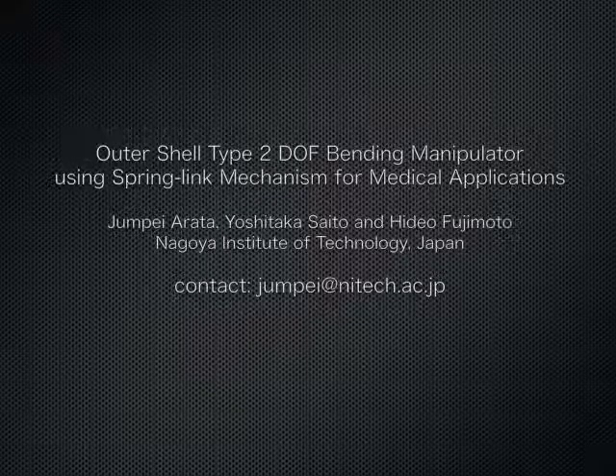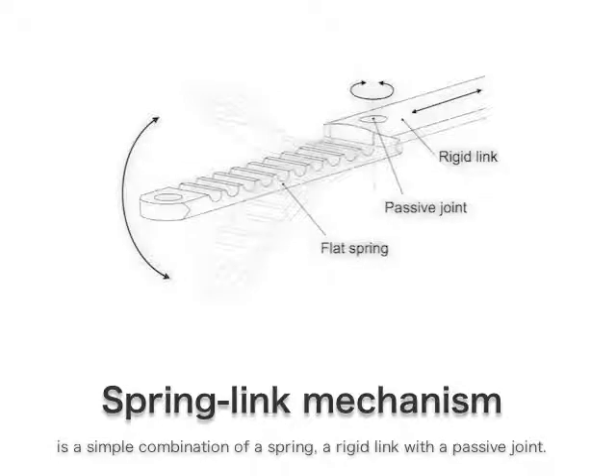This video shows an outer shell type 2 DOF bending manipulator using a spring link mechanism for medical application. The spring link mechanism is a simple combination of a spring and a rigid link with a passive joint.